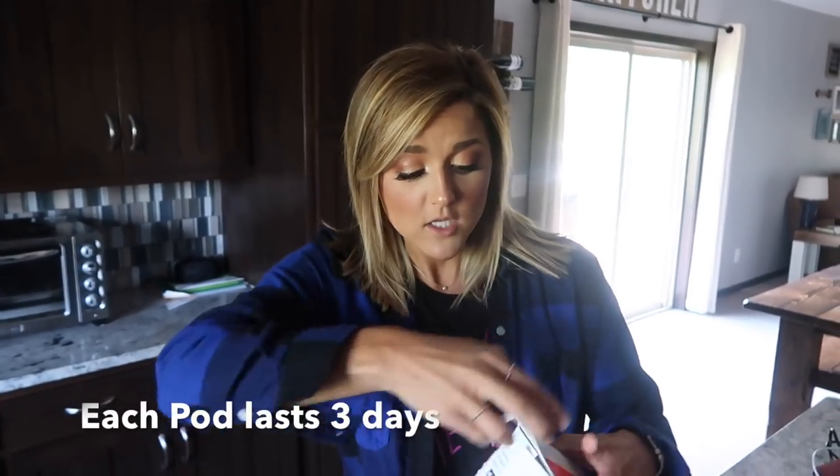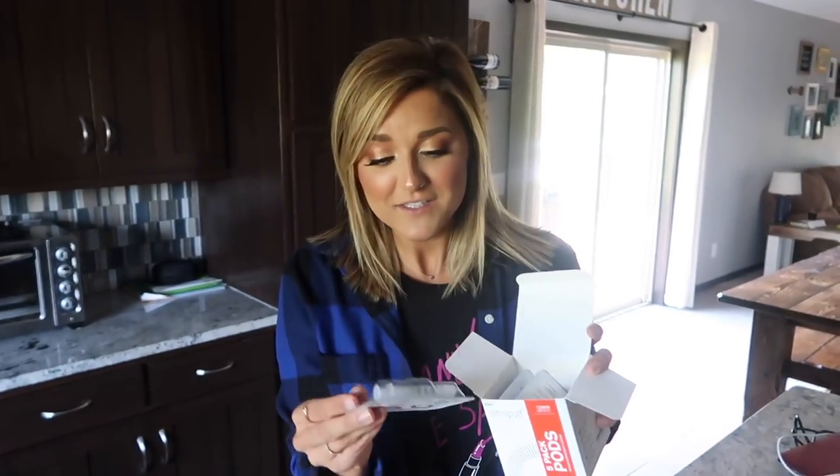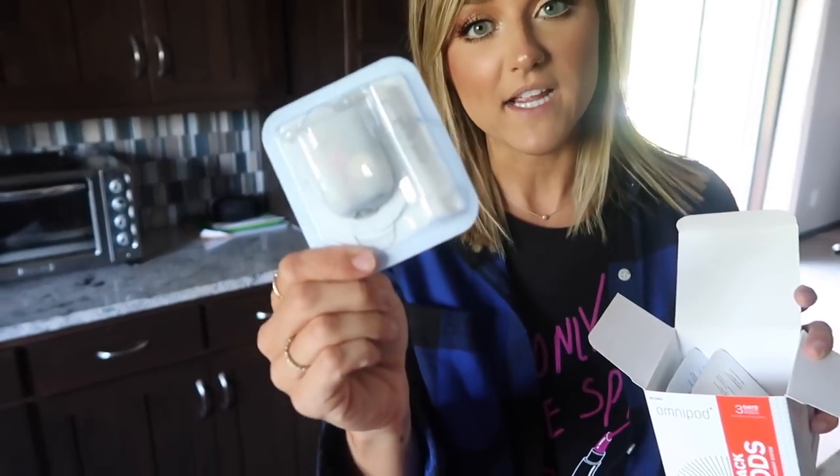Since Nevaeh did switch to the Omnipod and the Dexcom, we don't have to bring as much stuff, which is wonderful. The Omnipods are awesome because basically all we need to bring is her pods, which come in a box like this. We have three — it's better to be safe than sorry. They basically come in a package, and there's the syringe.